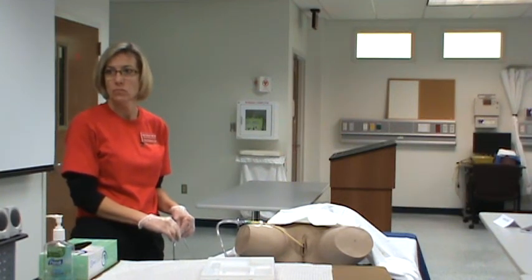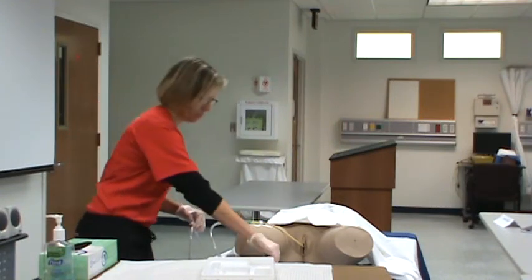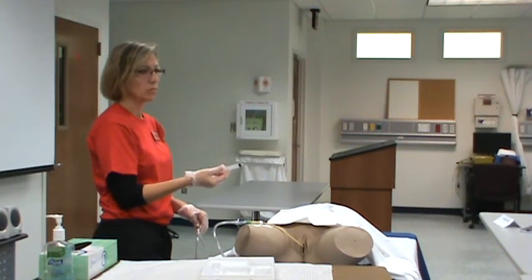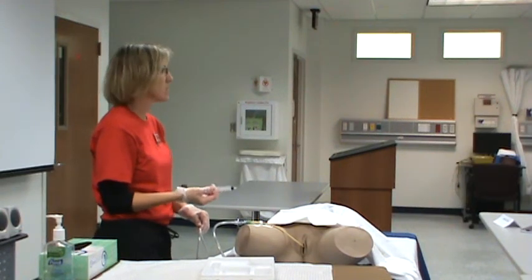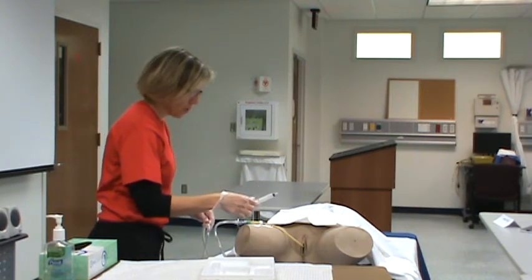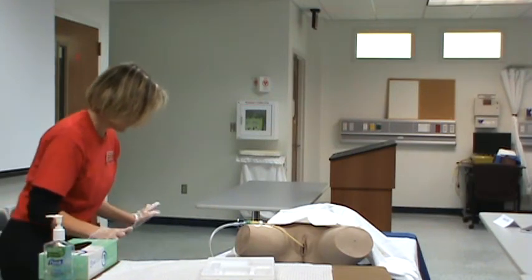And what kind of solution is in here? Normal saline. So it's not going to hurt the body if normal saline goes in that cavity. The cap will just fall out eventually, and so you'll know then as well. So here's my setup.